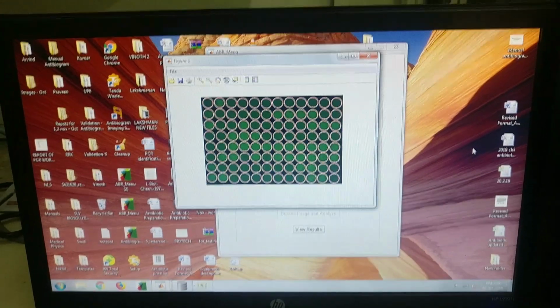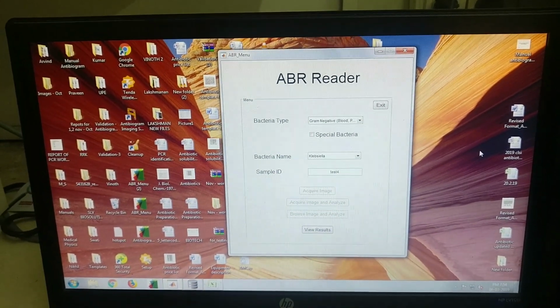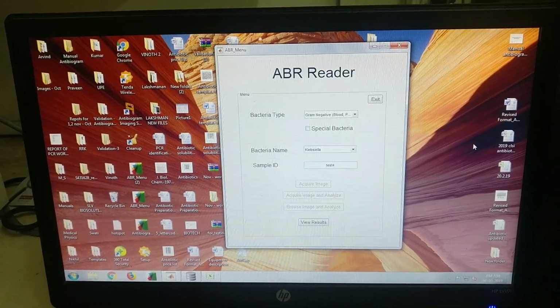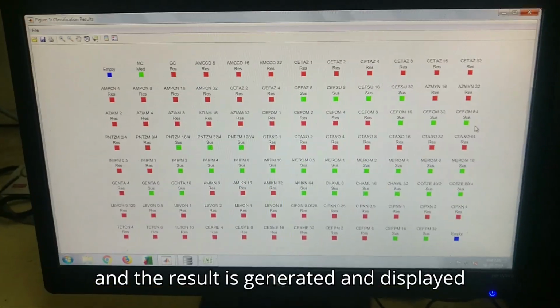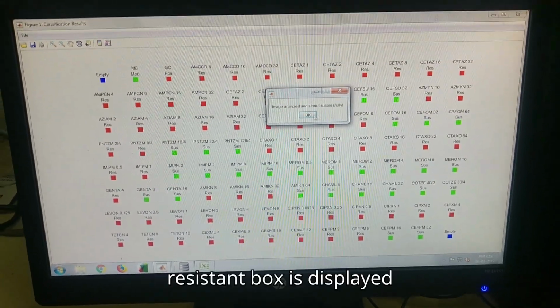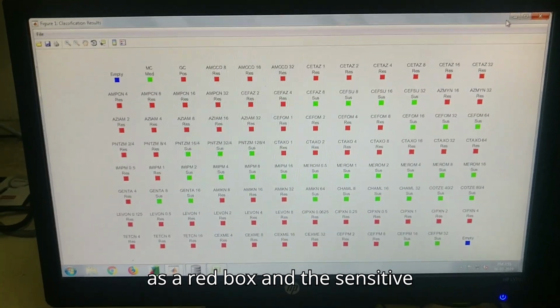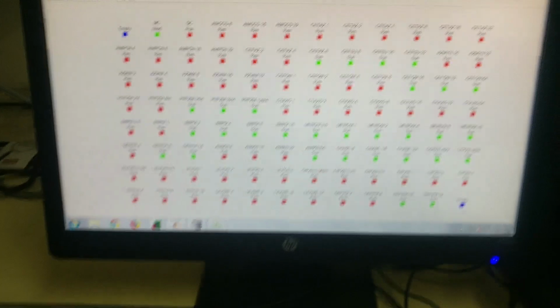processed, and the result is generated and displayed with 2 distinct color boxes. The resistant box is displayed as a red box and the sensitive box is displayed as the green box.